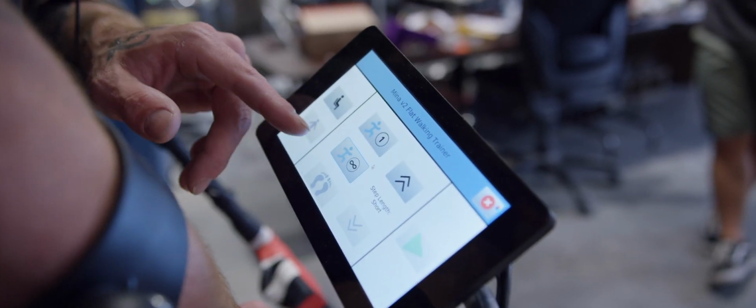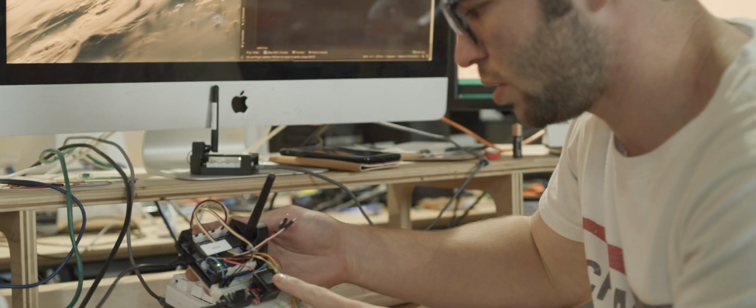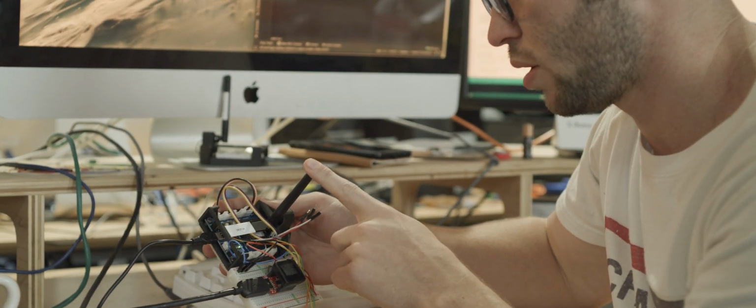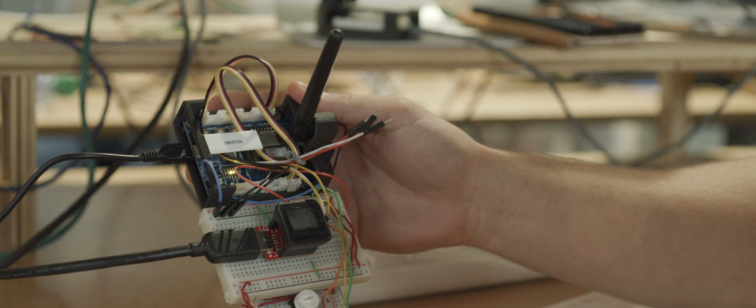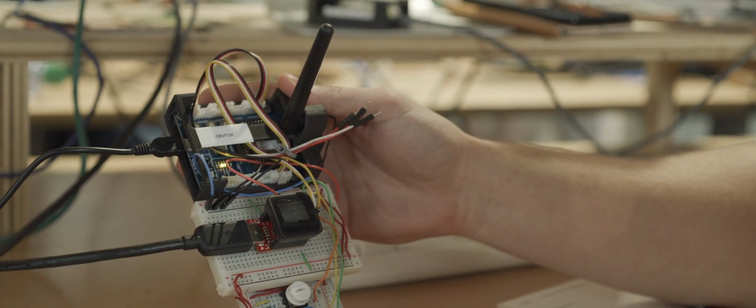So our current crutch uses a wired connection, which means we're constantly tethered to the device. And we have this big bulky screen. So we're trying to improve that by moving to a smaller screen and wireless data communication. Here I'm just prototyping what will eventually be embedded in the crutch. And the whole design of where everything is going to go in the crutch is what Tomas is working on right now.